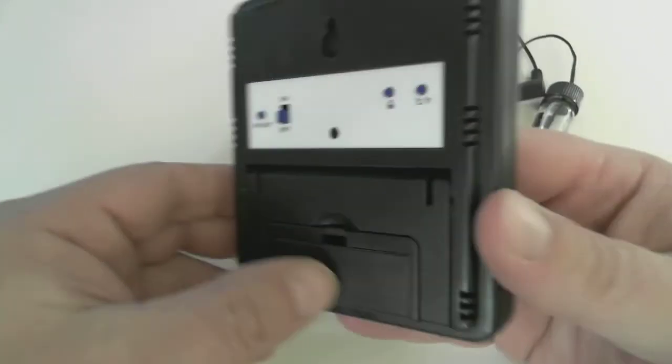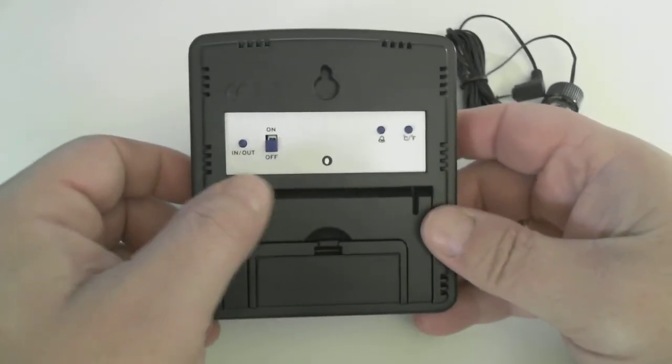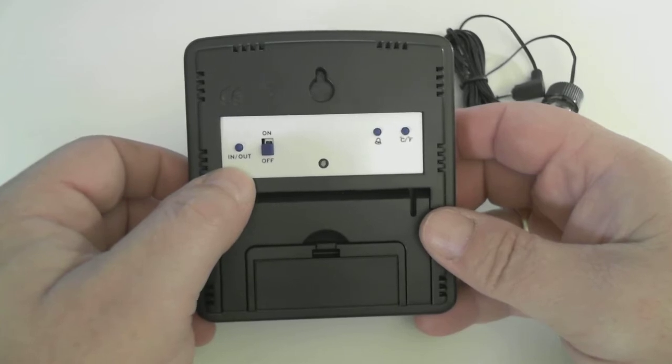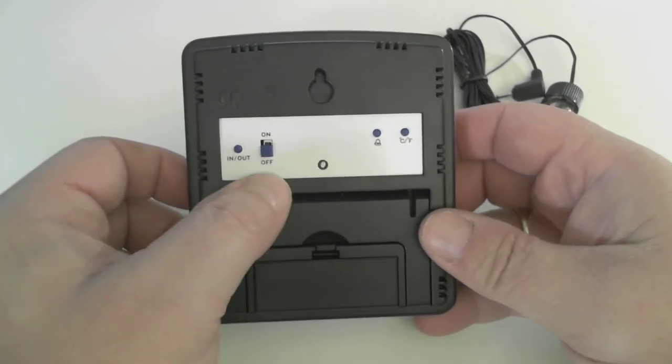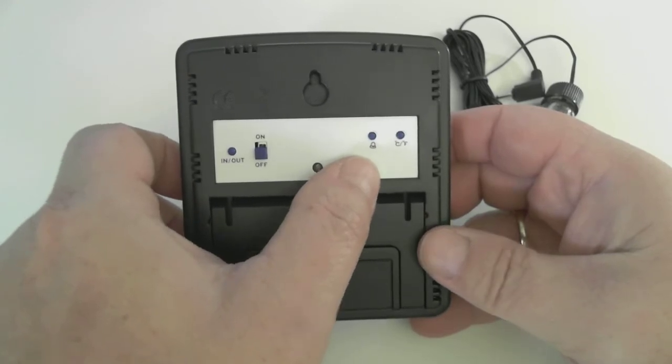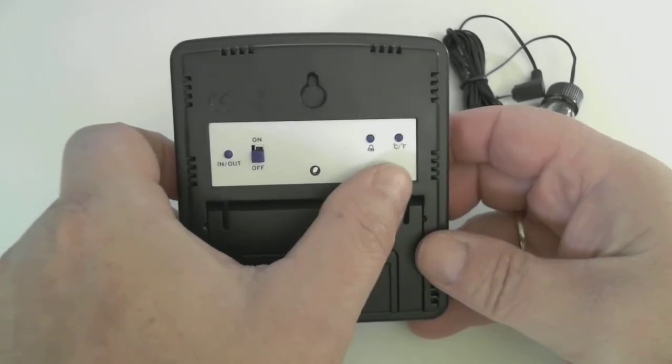Turn the unit over. On the back, we have three buttons and a switch. The far left button selects either the internal or external temperature probe, power on-off switch, audible alarm deactivation button, and Celsius and Fahrenheit selection switch.